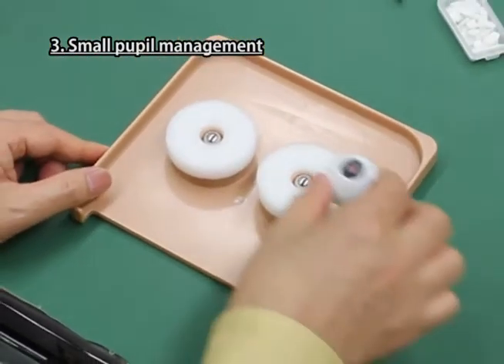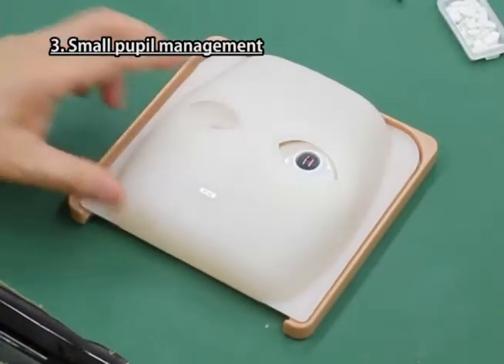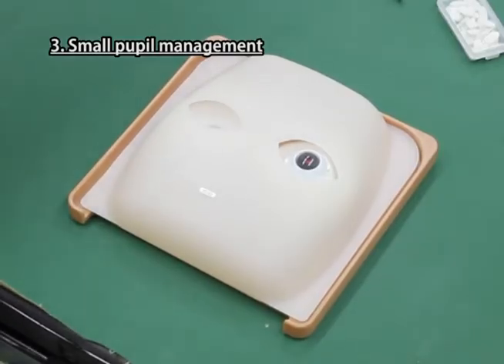Place the sponge on the iron ball of the right eye of the base plate and set the eyeball part onto it. Then cover it with the mask.